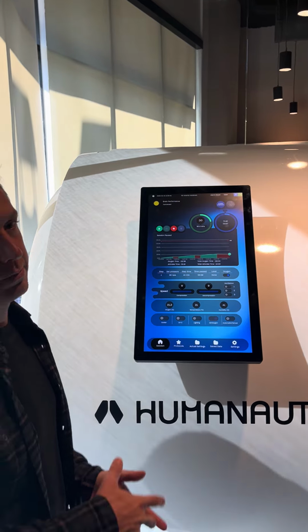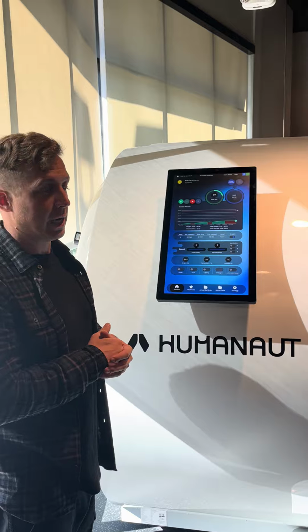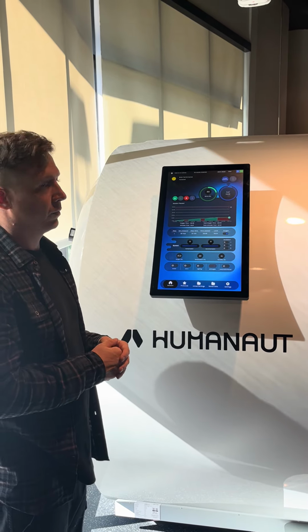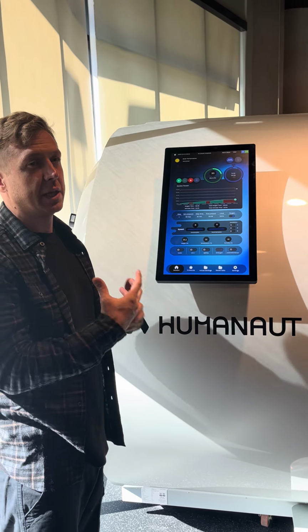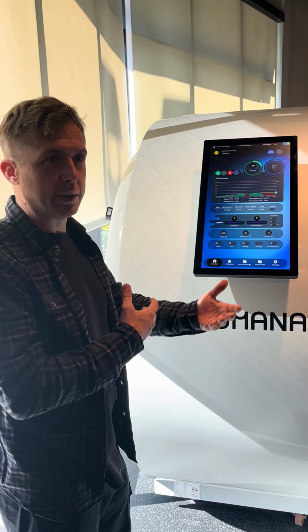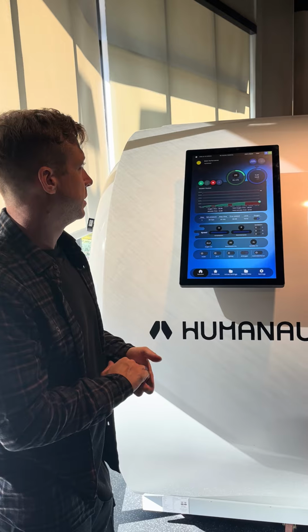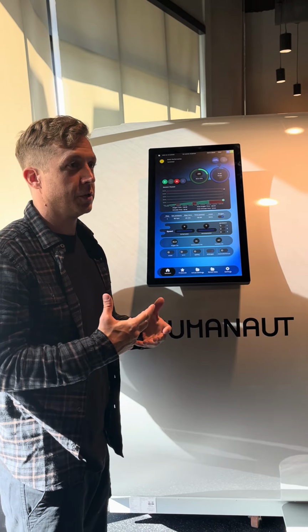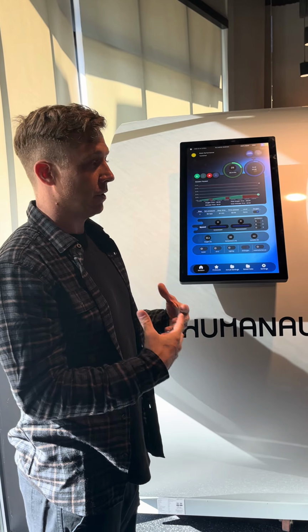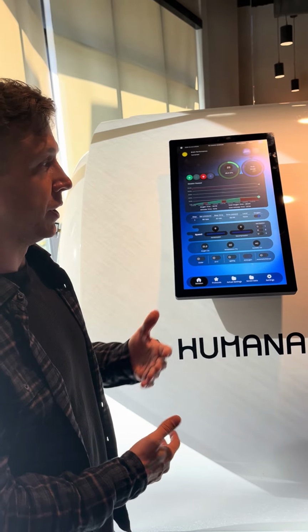And then it's always, if you're having trouble breathing, just take off the mask and breathe normally. It's difficult to exhale with less pressure in the chamber. So if you want to put the mask on when we get the pressure, it'll be a little easier to exhale at that point. But it does take some getting used to because you're not really ever using muscle to push out your breath. So that's unnatural, and that'll just take some getting used to, like 1, 2 sessions.